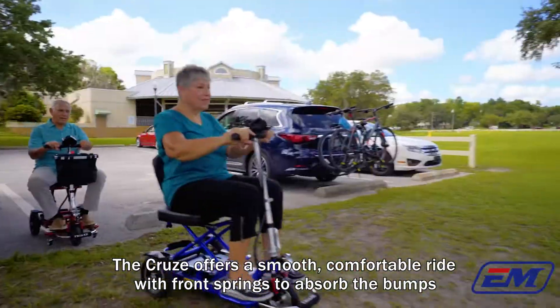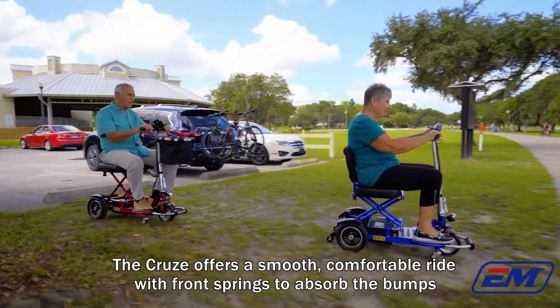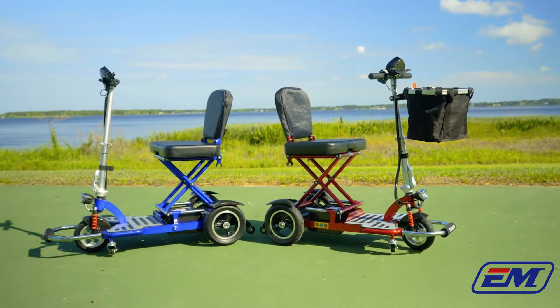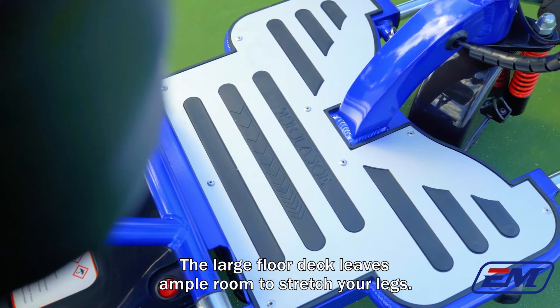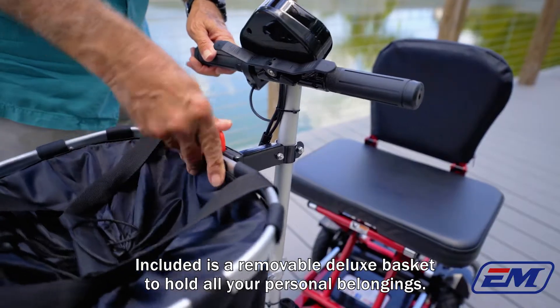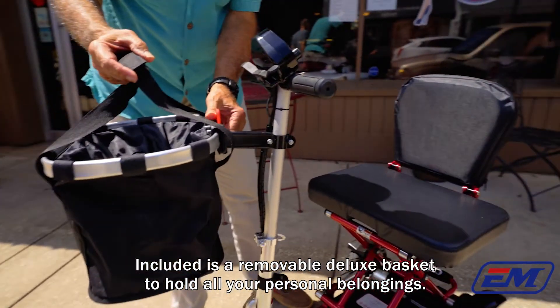The Cruze offers a smooth, comfortable ride with front springs to absorb the bumps and a roomy 18-inch seat with a high back to cushion and support along the way. The large floor deck leaves ample room to stretch your legs. Included is a removable deluxe basket to hold all your personal belongings.